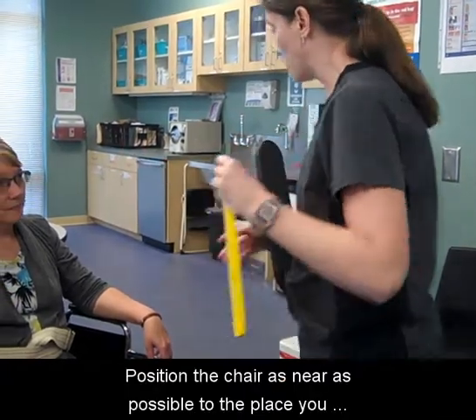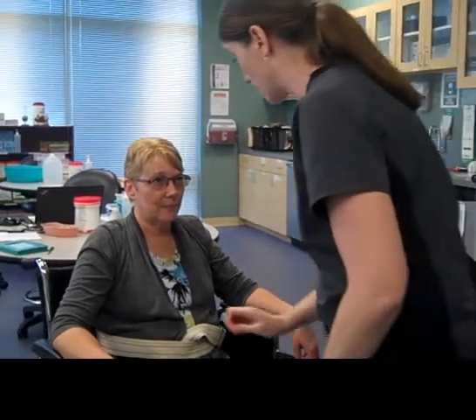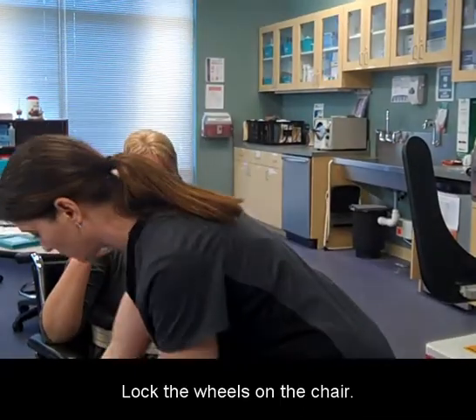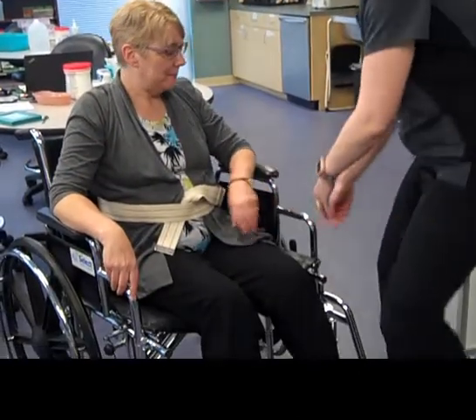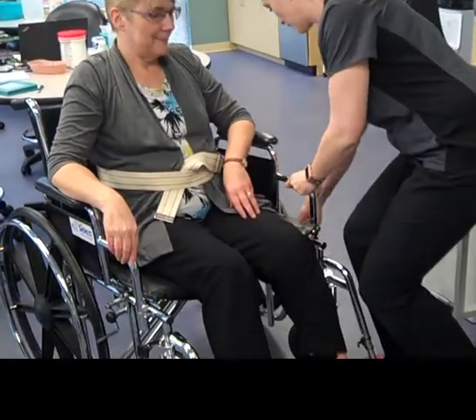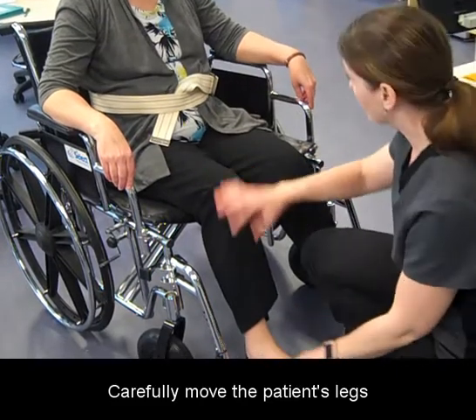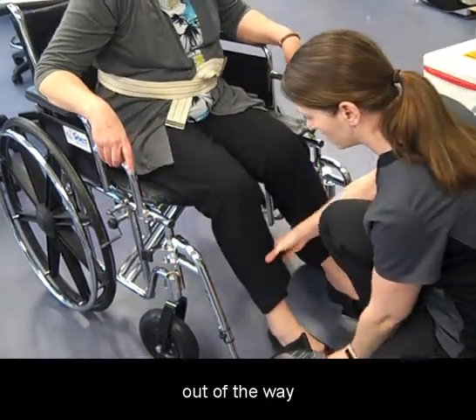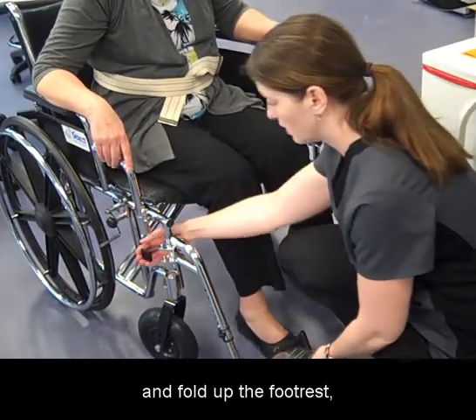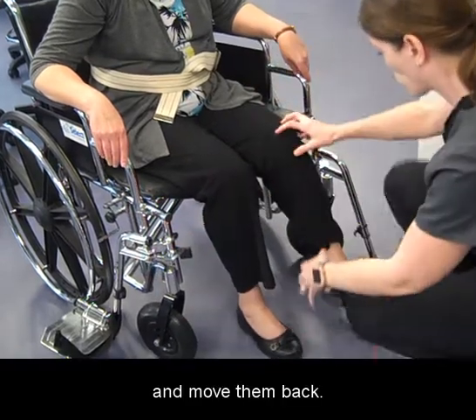Position the chair as near as possible to the place you want the patient to be. Lock the wheels on the chair. Carefully move the patient's legs out of the way and fold up the foot rest and move them back.